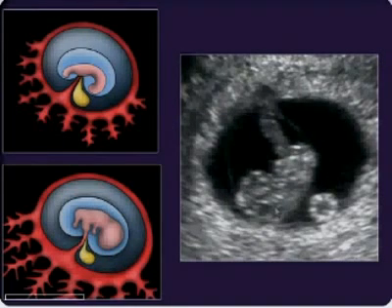As we get a little further out, the embryo is now growing. We have a nice C-shaped embryo. You can see the cord. Look at the amnion here. The amnion still forms quite a tight little capsule around there. It's kind of a baby in a bubble look. And the chorionic cavity is still larger than the amniotic cavity at this point. Notice that the yolk sac is outside the amnion. The yolk sac lives in the chorionic cavity.